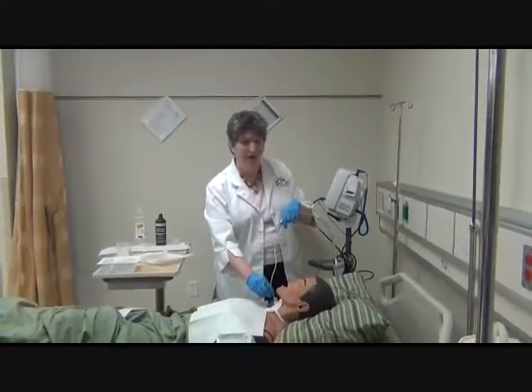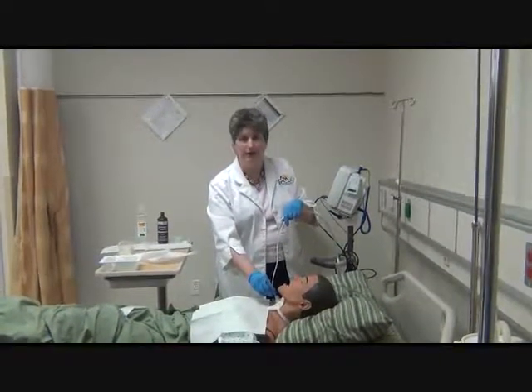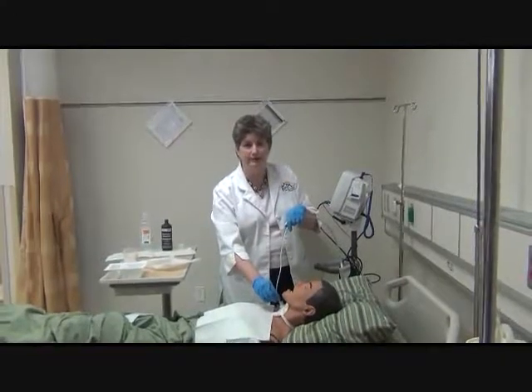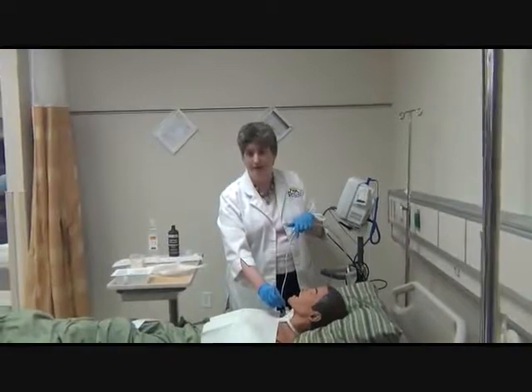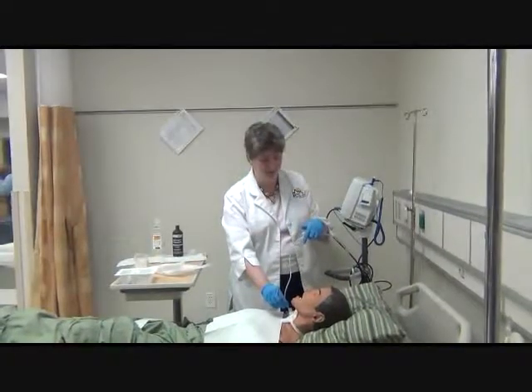And if you go far and you hit the carina, your patient's going to cough. This usually, because it does move a little bit in the trachea, it does stimulate a cough, which helps loosen up those secretions, and hopefully we'll get more.